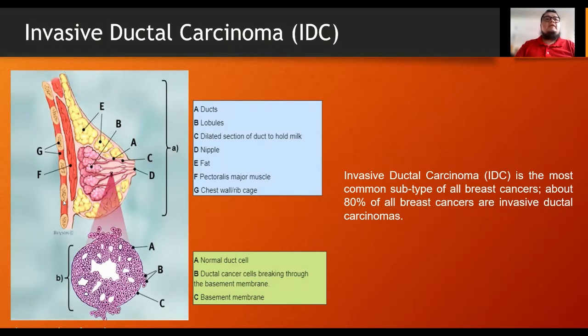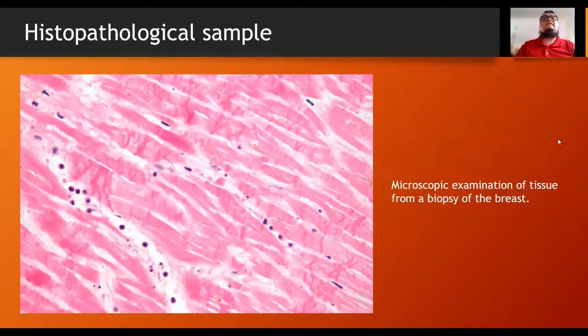You can see letter B below the figure. You can see that cancerous cells are outside the duct. So to detect this type of cancer, we obtain a biopsy from the breast, and pathologists perform an analysis of this sample, and they determine if it's cancer or no cancer.